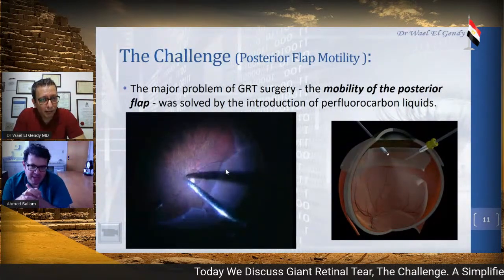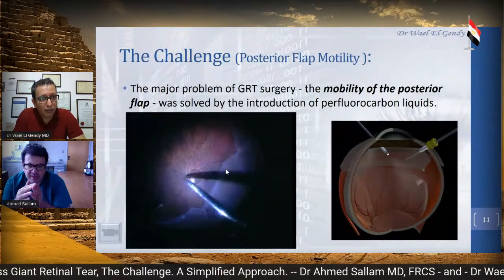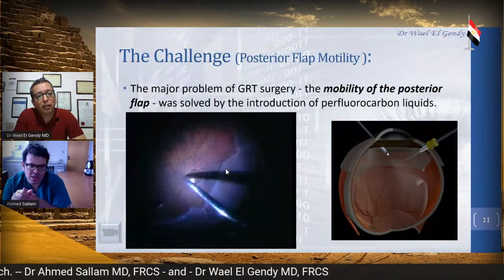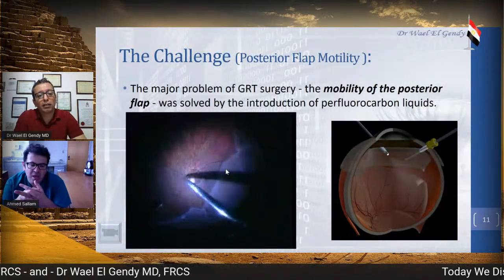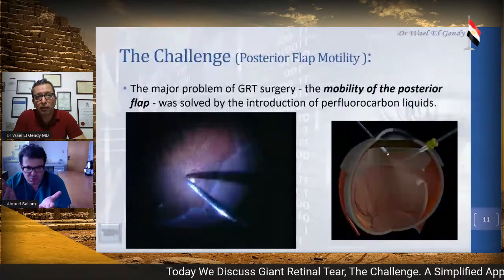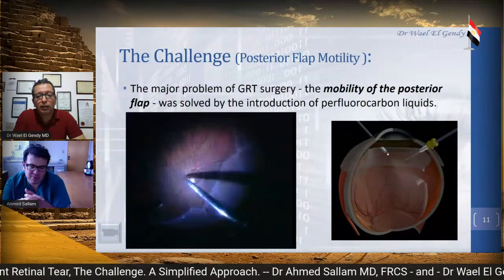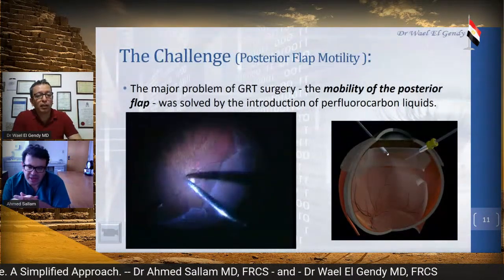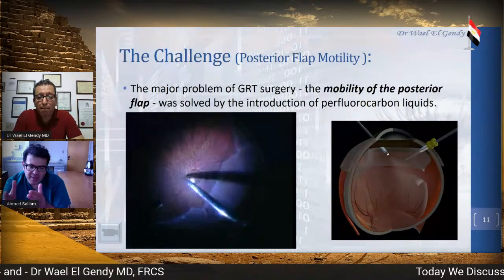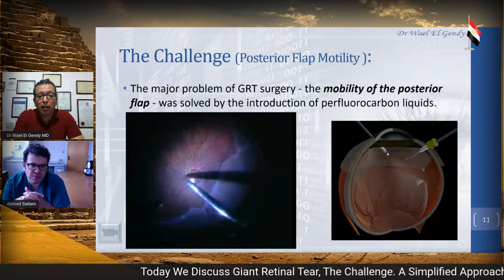Like everyone else, I would use PFCL. So I would start, as you very nicely showed, doing the vitrectomy, I would use Kenalog. I always use Kenalog in detachment, although most of these patients have vitreous separation, but I think it's good to use, to not waste time and find that some patients do not have vitreous separation. Then once I'm done with this, at least in the posterior pole, I will use PFCL to put the flap back. That's what I would do.